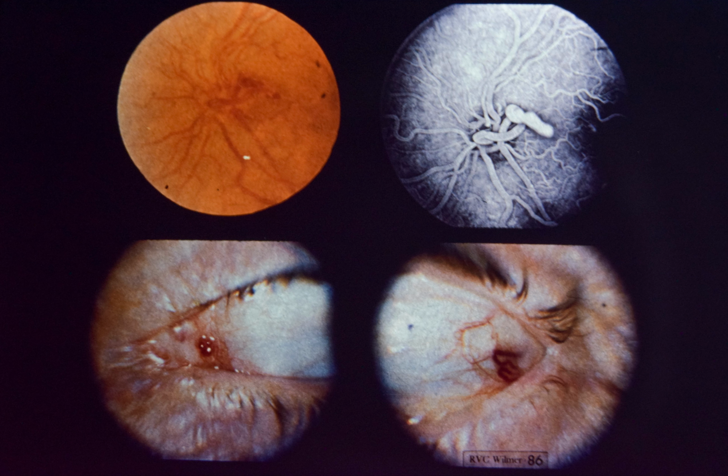Upper left, note arteriovenous malformation of the left disc. The vascular loop extends about 1 disc diameter into the vitreous cavity. Upper right, AV malformation is filled with dye but does not leak. Photographs taken 30 minutes after injection also showed no leakage of fluorescein.